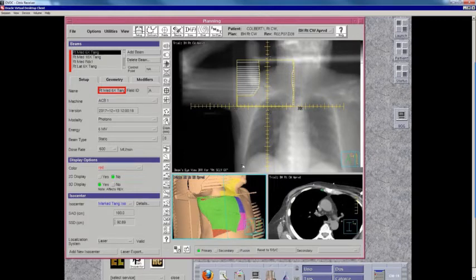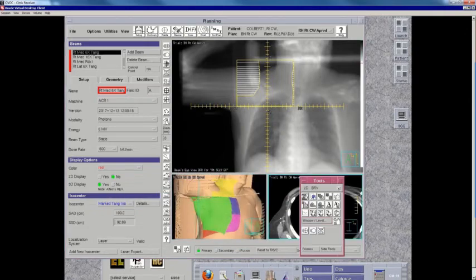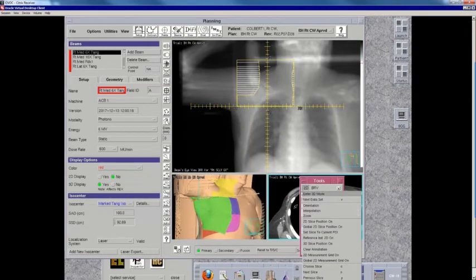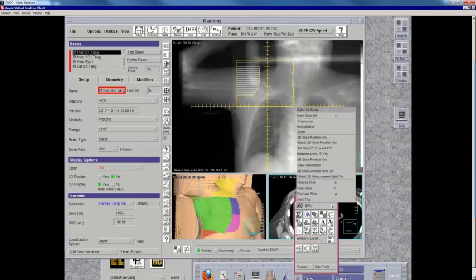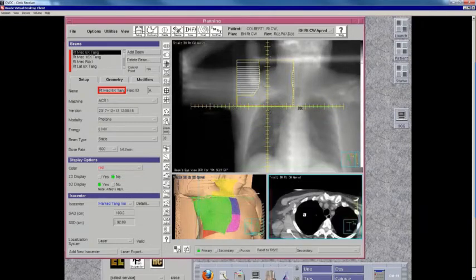As far as the field design, this is my supraclavicular field. She had N3C disease, and in the setting of N3C disease, we like to go higher and cover close-ish to the mastoids. So I went close. I at least went up a little bit into her mandible. Let's take a look at that.